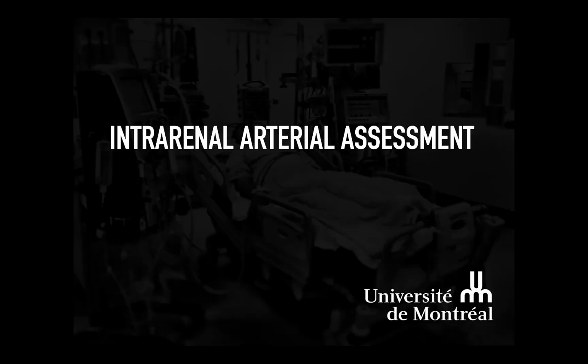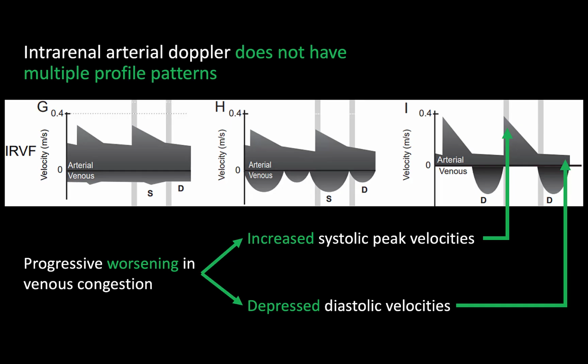In the next section, we will discuss intrarenal arterial assessment. Intrarenal arterial assessment is overall a newer technique in the realm of critical care medicine. It is the area where the most uncertainty and most research is yet to do. The key difference in the intrarenal arterial Doppler compared to the venous is that there are not multiple profile patterns that can be qualitatively assessed to determine pathology.